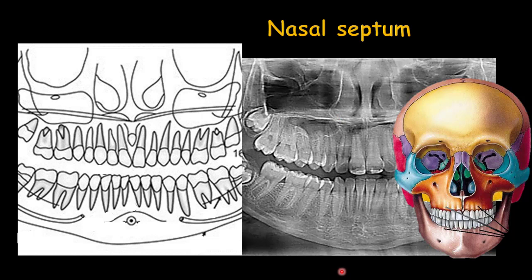The nasal septum is the bony part between the nasal holes. It is made of the vomer bone and the perpendicular plate of the ethmoid bone. You can see it in this panoramic radiograph.